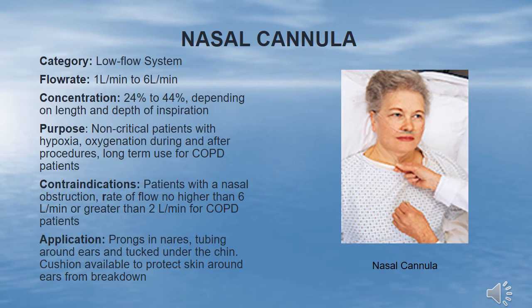For instance, at a setting of 1 liter per minute by nasal cannula, the patient inspires 24% oxygen. 2 liters per minute gives 28% oxygen. 3 liters per minute gives 32% oxygen, and so on up to 6 liters per minute.